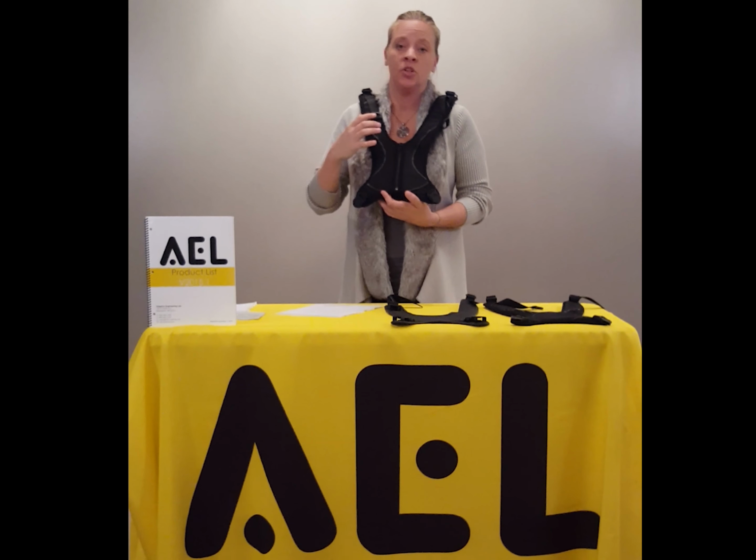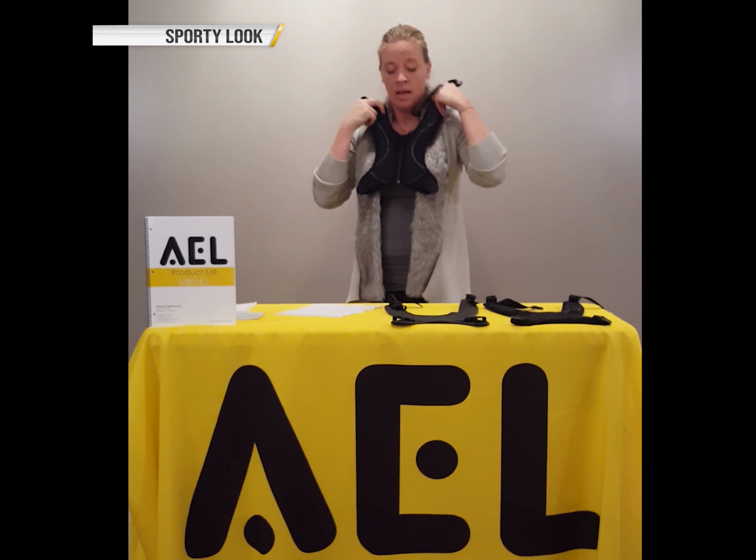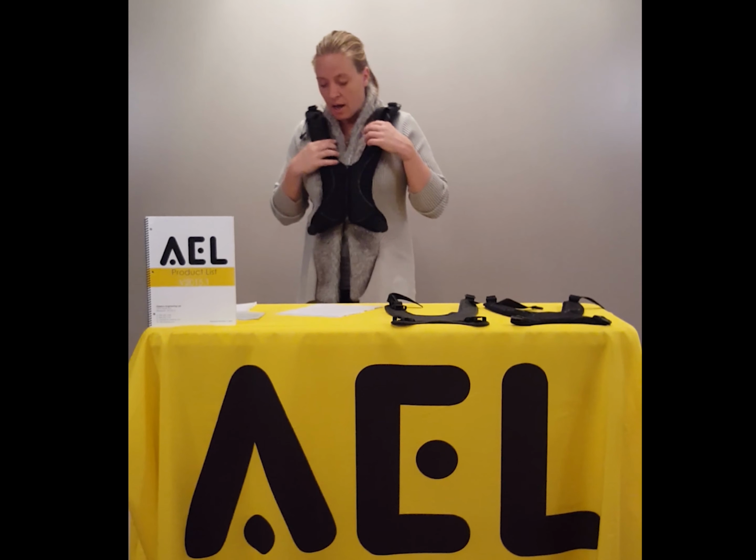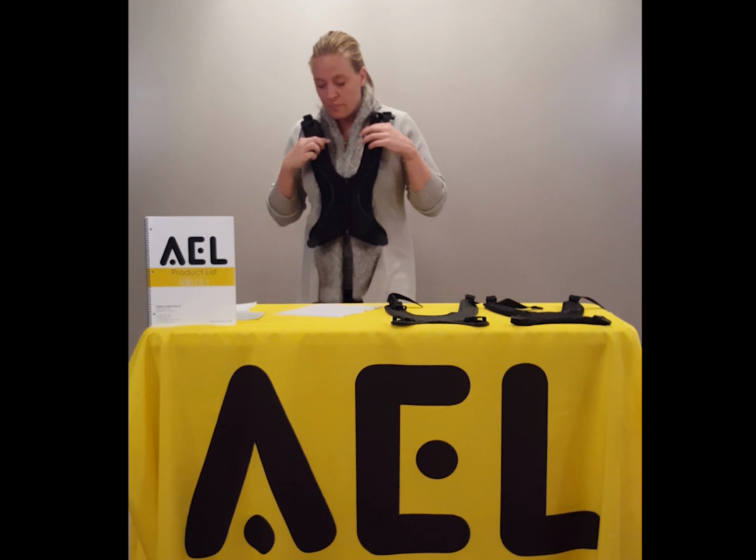It's also cosmetically friendly. Some clients prefer it because it is a little less medical in appearance as a result of the zippered front. Something to think about is if you have a client who has, again, significant weakness of the hands, they're not able to grasp the buckles, they don't have the pinch in those fingers to release those buckled options, the zippered option may be a more appropriate option to choose.